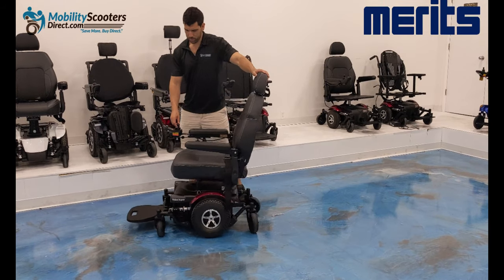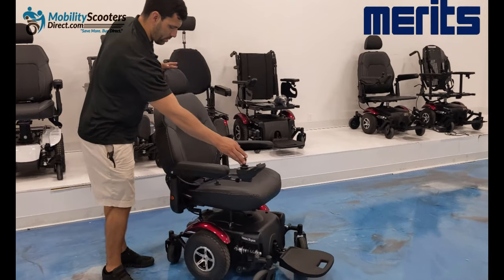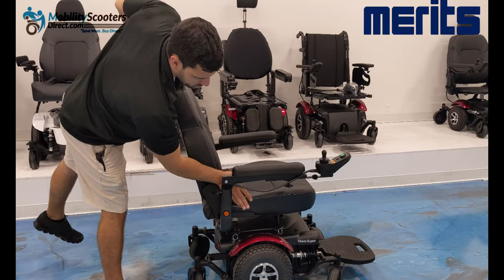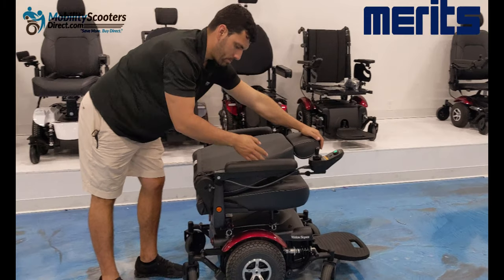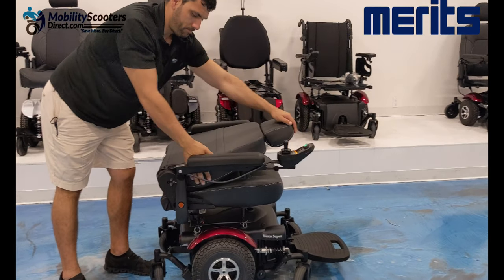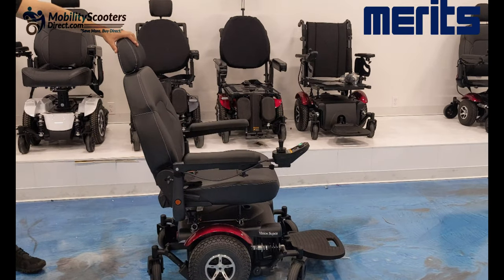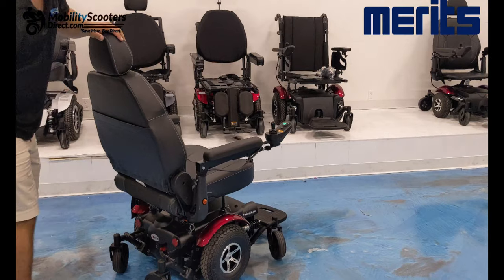The chair has a semi-recline option and the ability to fold flat forward using the recline lever on the right side. This makes it convenient for transporting the chair once you remove the top part. With the chair folded all the way forward, it's pretty compact, making it very convenient for transportation.